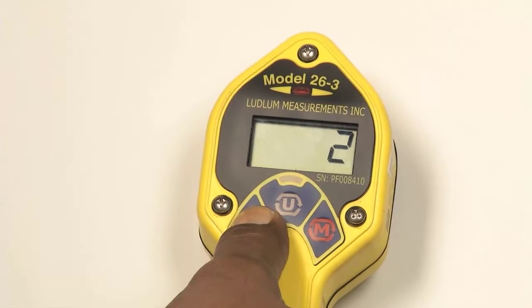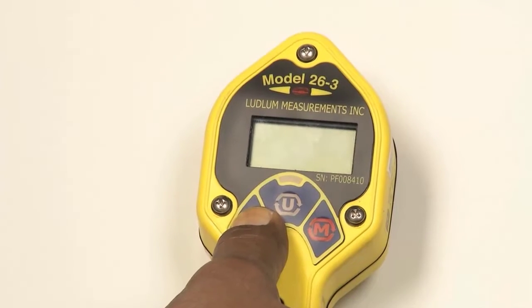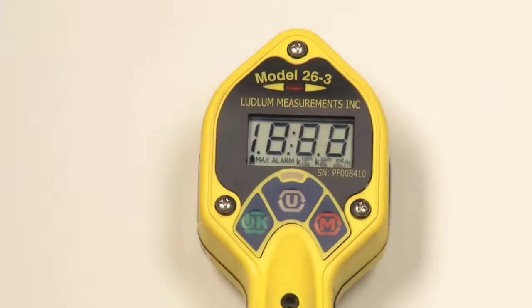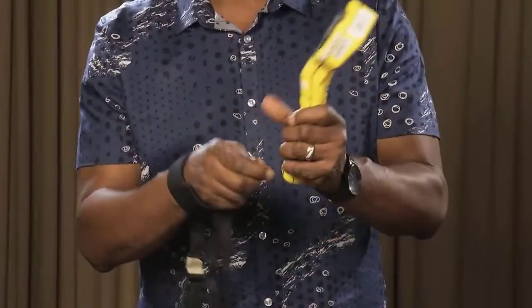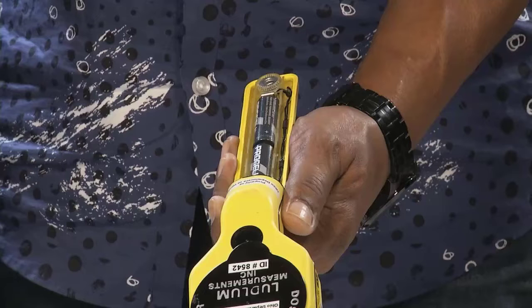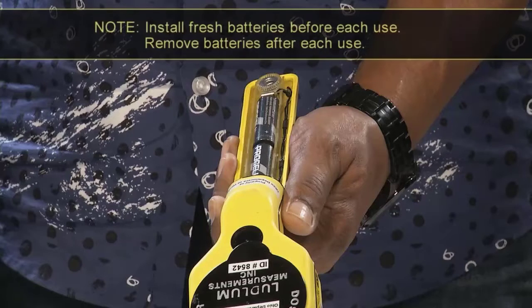The instrument features a large backlit liquid crystal display, or LCD, and a piercing audio warning. A comfortable wrist strap and lanyard are also included for hands-free operation. The unit is operated with two AA alkaline batteries. Note: install fresh batteries before each use.